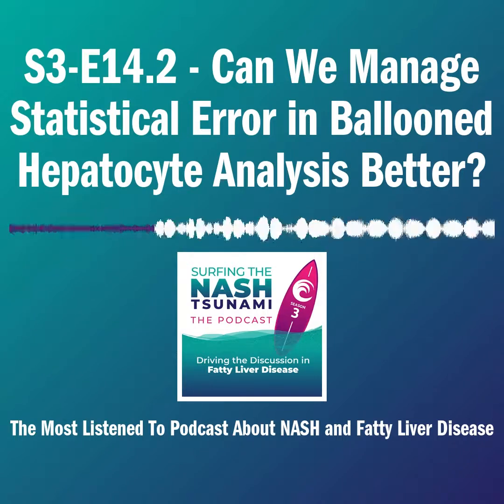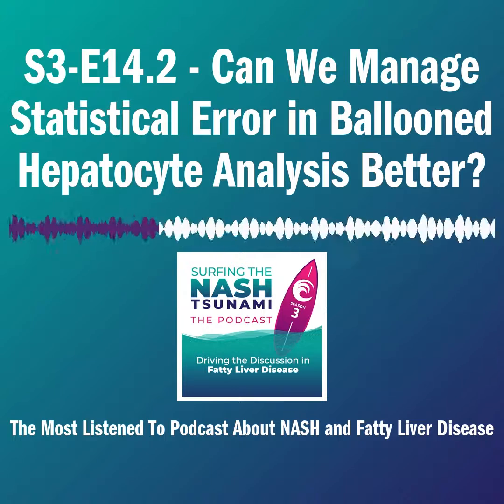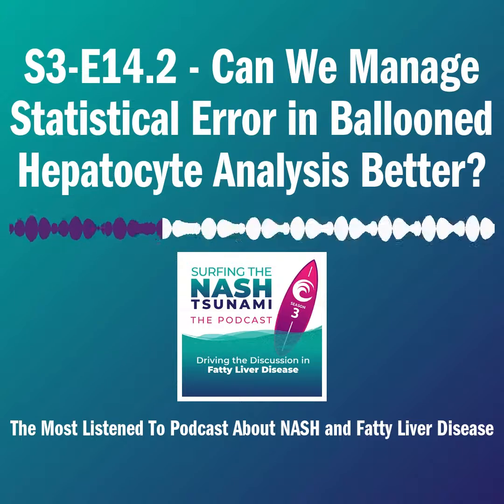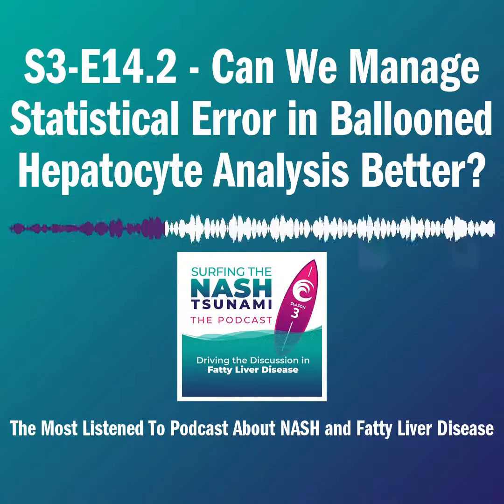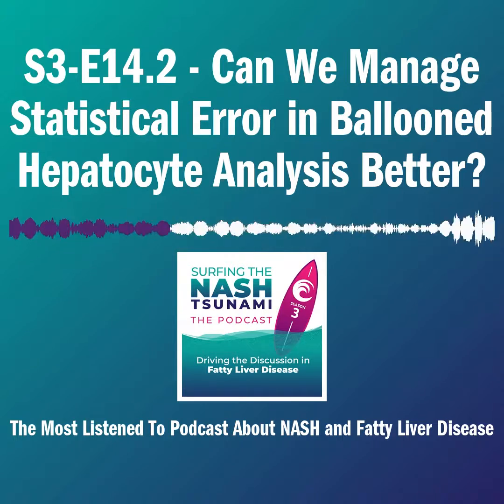I don't think this is about doing away with human histopathologists in trials, but what I would like to see is the use of these techniques either to guide where ballooning might be, and that's something we're already seeing in radiology, for example, where they're looking at images and they have AI assistants to help them spot nodules or lesions that may be difficult in scans. So I think there's the concept of an assistive technology like that.